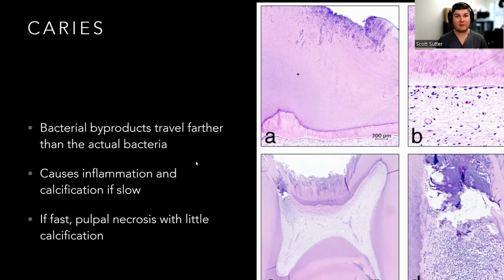Anyway, I see a fair amount of kids, and they are some of the easiest root canals from a technical standpoint because the caries has created an access larger than a first-year dental student's. It is the biggest, largest. It's pretty much just a shell of enamel on there, and it's because once it gets inside there, they go hog wild, and there's other reasons for it as well. But this is what happened in this patient's situation, is that decay was a little bit slower. He had already had a lot of restorations and he had calcification inside there.